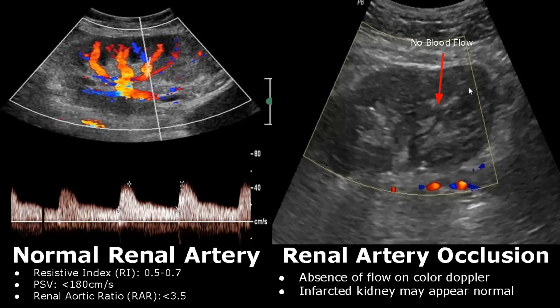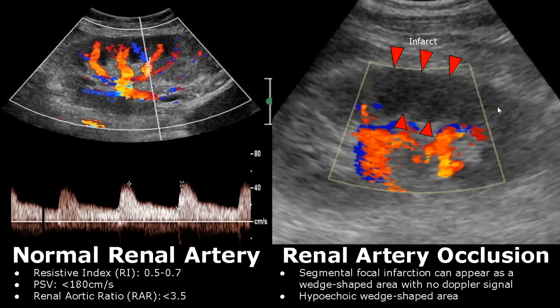The first case is renal artery occlusion. Color Doppler is applied here but there is no blood flow noted inside the kidney, which means there is renal artery occlusion. This leads to an infarcted kidney. An infarcted kidney may appear normal on ultrasound. This is an image of a segmental focal infarction — no Doppler signal is found here, indicating an occlusion. A wedge-shaped hypoechoic area is seen.